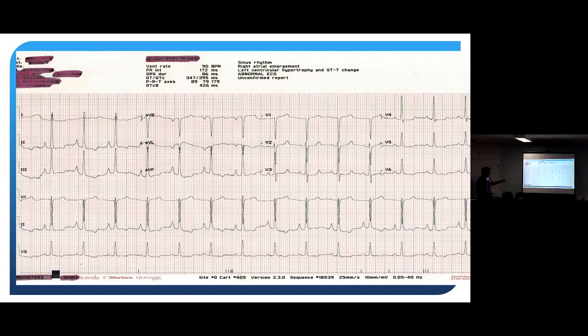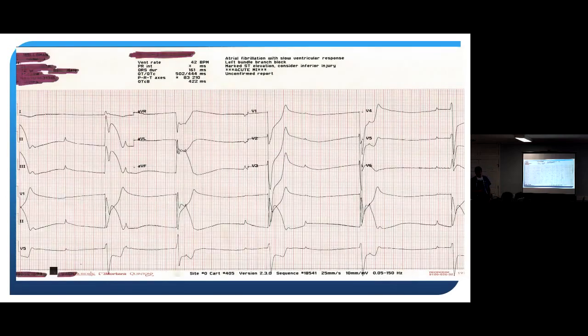This guy was seen in the ER for weakness and nausea. The 12 lead was fine. He waited about 2 hours, finally got back to our room. And as he's talking to one of the docs, they noticed a rhythm change. So what is that? Don't use profanity. Bad. That's the first thing I said, is I said something inappropriate under my breath.